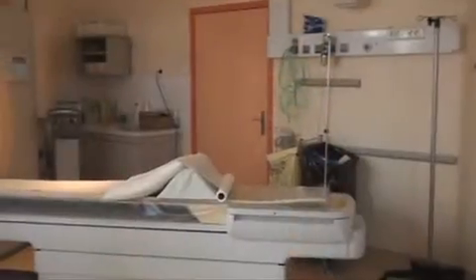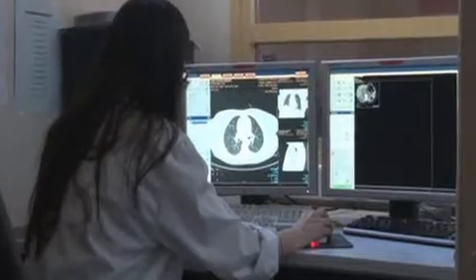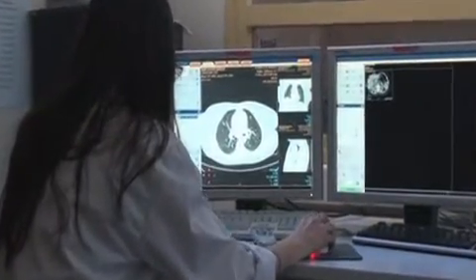If you look at the development of CT from the early 90s to now, you can see that CT has moved from step-by-step single-slice acquisition to spiral CT to multi-slice spiral acquisition, which ultimately allowed you to get isotropic imaging. That will help us evaluate cardiac function and cardiac perfusion, which is something we can't do at the moment. It will also help us evaluate lung function, lung ventilation. I think that there CT will have a role.